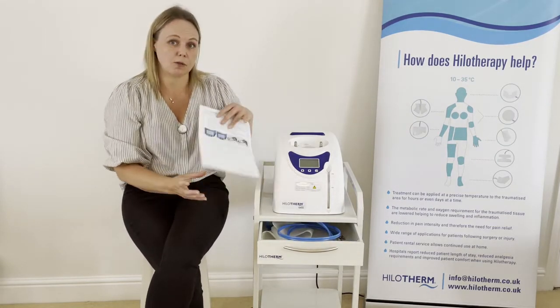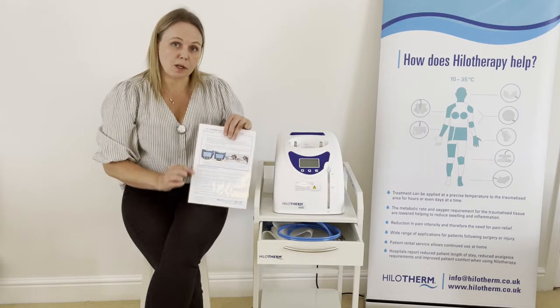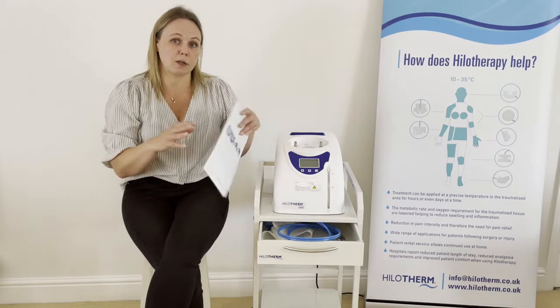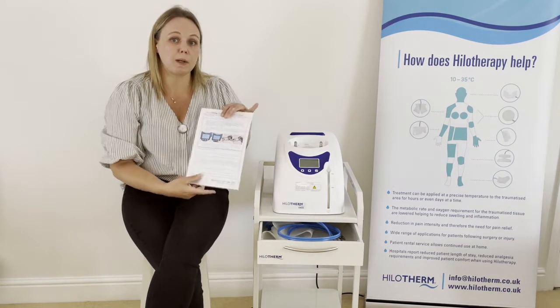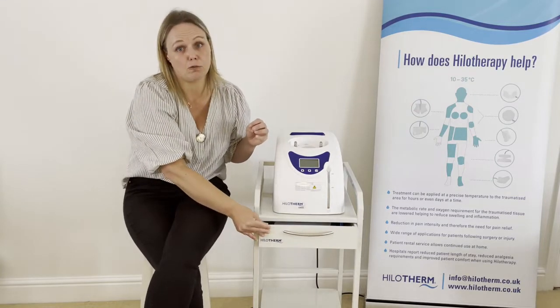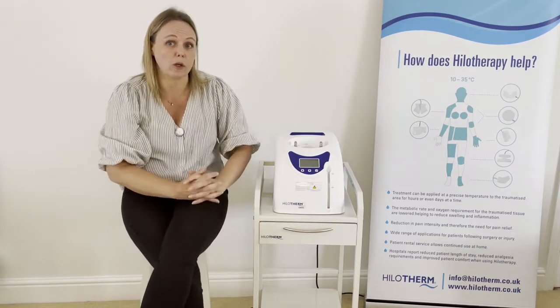It has step-by-step user instructions on it, but there is also troubleshooting information. Everything I cover in the video today is also on the laminated sheet, so please do look out for that, particularly in the trolley or if your device is on a trolley.